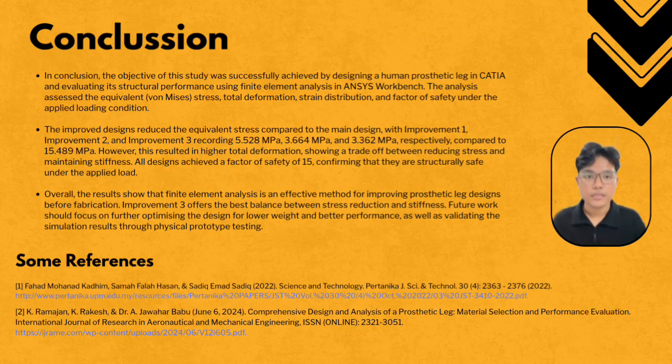In conclusion, the objective of this study has been successfully achieved by designing a human prosthetic leg in CATIA software and evaluating it using finite element analysis in ANSYS Workbench. The analysis assessed the equivalent von Mises stress, total deformation, strain distribution, and also factor of safety under the applied loading condition.